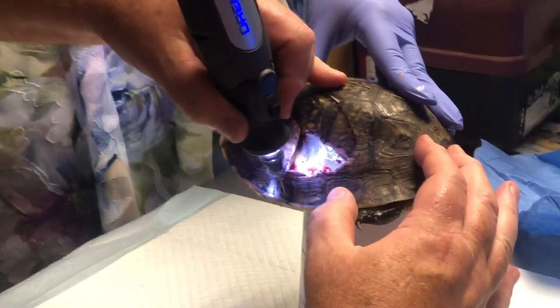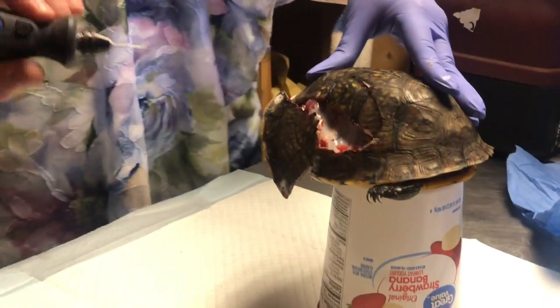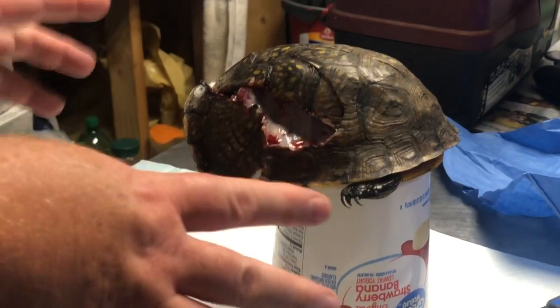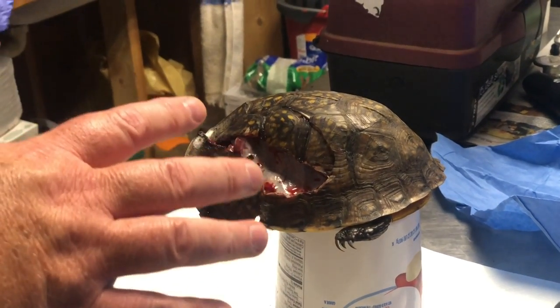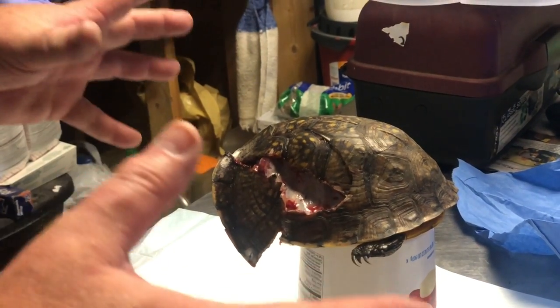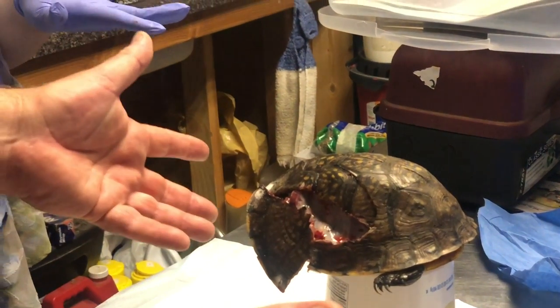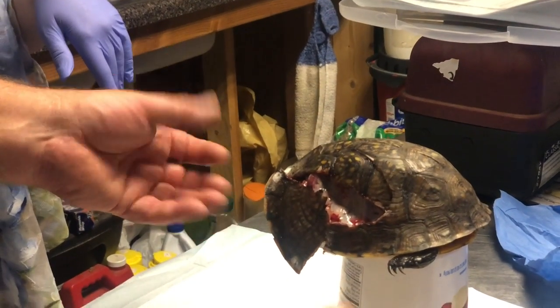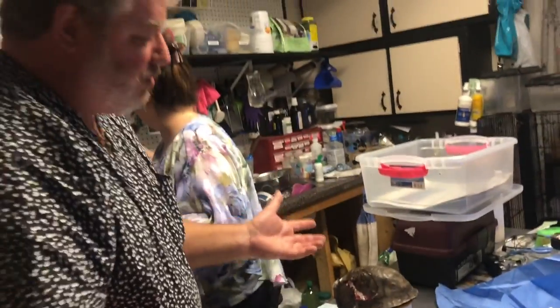For those of you watching, this is a Terrapin Carolina. This one was hit by a car a while back — we've lost tons and tons of blood, I've seen several pictures of this guy between then and now. We would normally sedate him for this procedure, but we've lost so much blood and he's so traumatized and in shock that it's just easier to put in these small holes, which is equivalent to a piercing. Hopefully we can save this turtle's life — that's pretty much what we're trying to do right now.